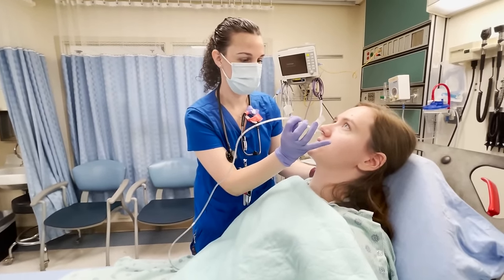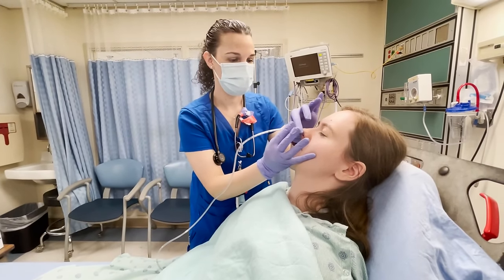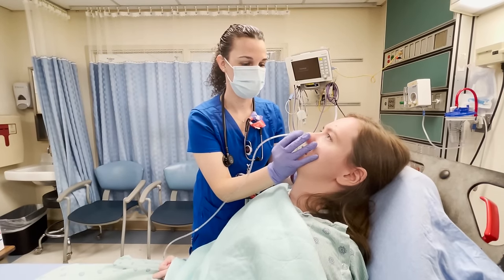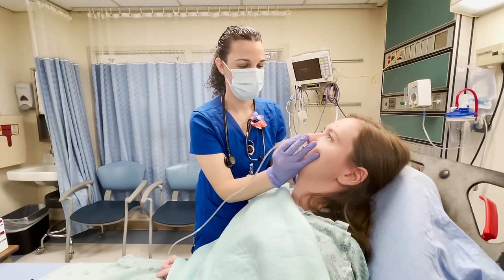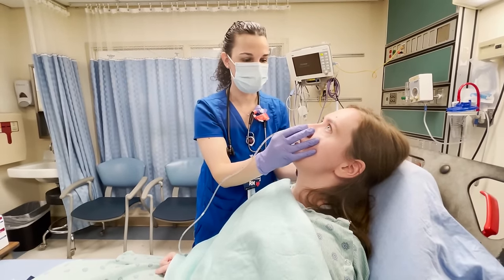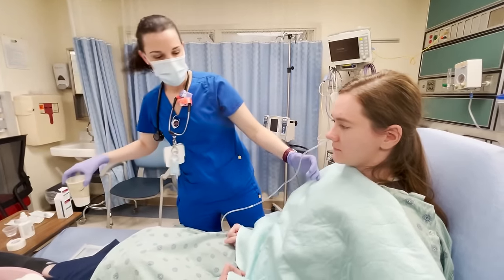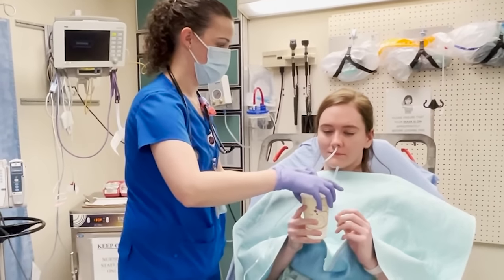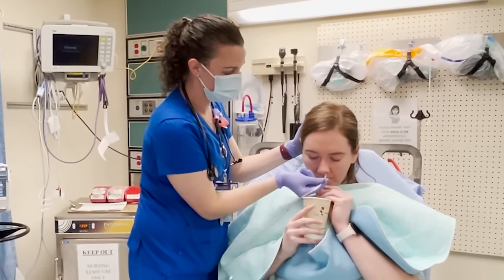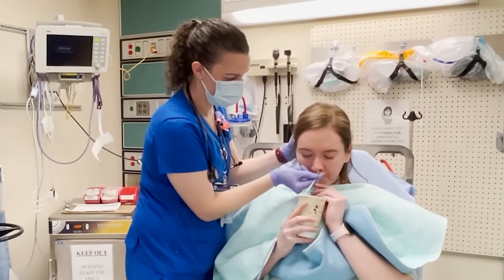One, two, three — okay. Open up. You can see the back of the throat. Lean your head forward, I'll give you the cup of water. Just start swallowing — swallow, swallow, swallow, swallow.